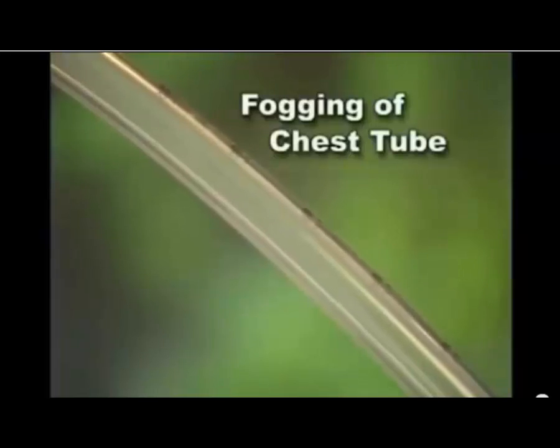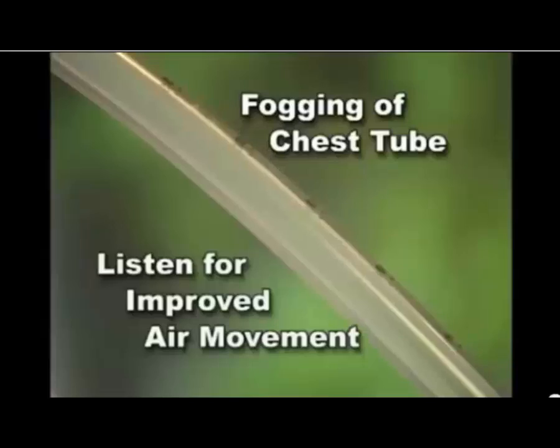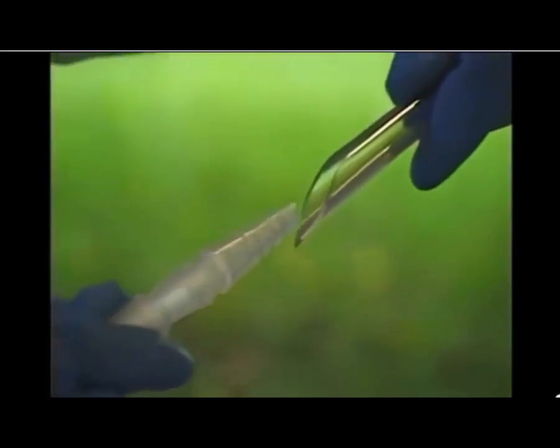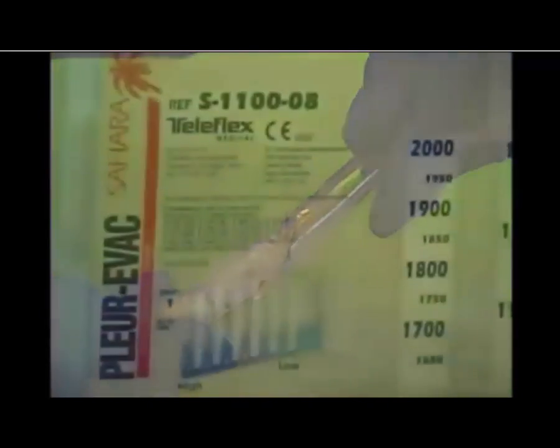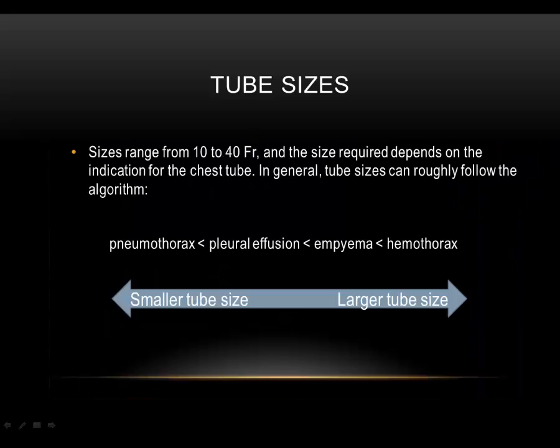It may be possible to see fogging of the chest tube with expiration, and it may be possible to listen for improved air movement on the affected side. Connect the end of the tube to an underwater seal apparatus collection chamber. Sizes range from 10 to 40 French, and the size required depends on the indication for the chest tube. In general, tube sizes can roughly follow the algorithm pneumothorax, pleural effusion, empyema, and hemothorax.